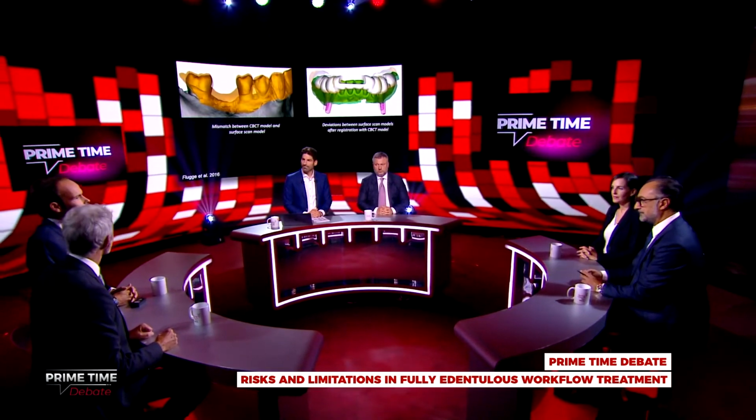Another point is who is actually doing the superimpositions. First of all, is it an automated process? Who is responsible for it? Is it maybe even a support center, a dental technician handling those steps? So this can be a very critical factor, and I think it's important if you do guided surgery that either you know how to do it, or you ask somebody who knows how to do it. Default segmentation, up to date, is still not really good enough.